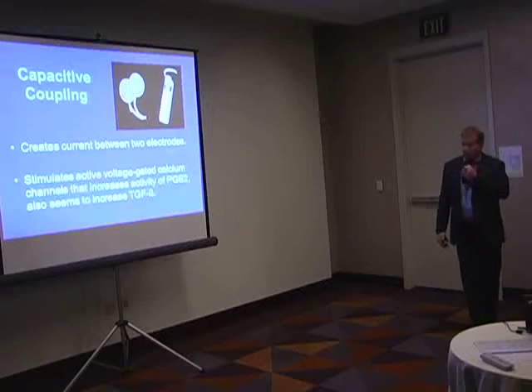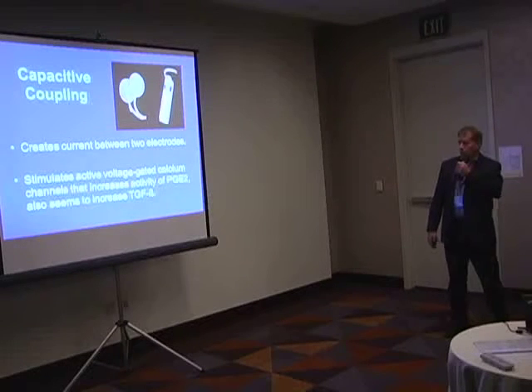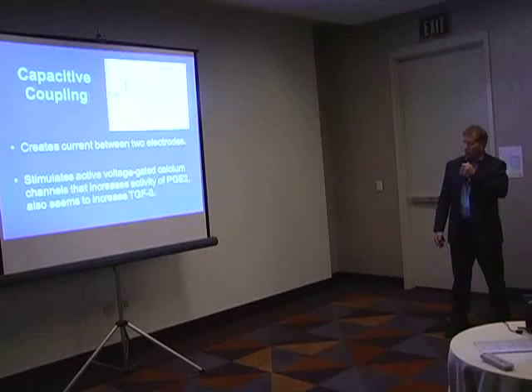Capacitive coupling is a way of creating a sinusoidal signal between two electrodes that are placed on the surface. And again, these fields stimulate all sorts of things. And in this case, it's been shown to activate voltage-gated calcium channels, and again, leading to increase in these cytokines that we know to be important in bone healing.